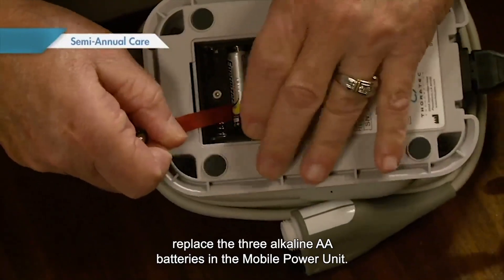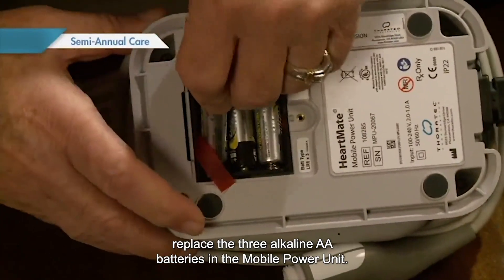Every six months, replace the three alkaline AA batteries in the mobile power unit.